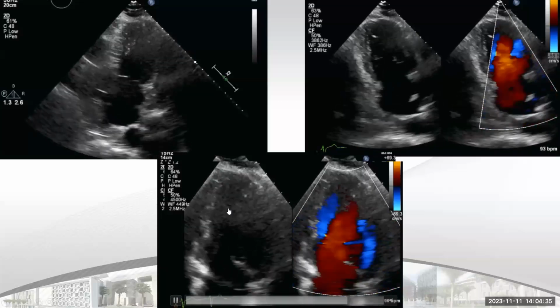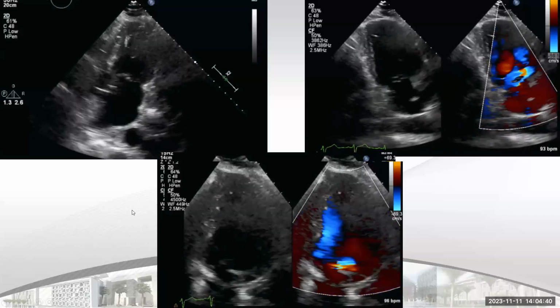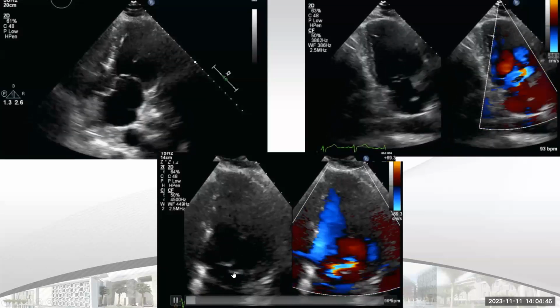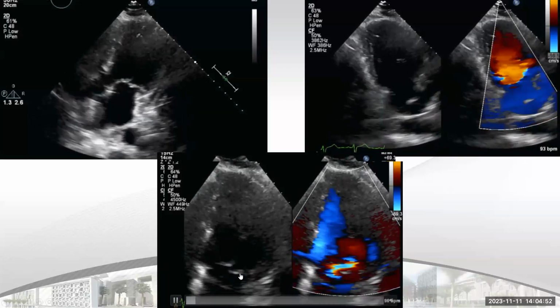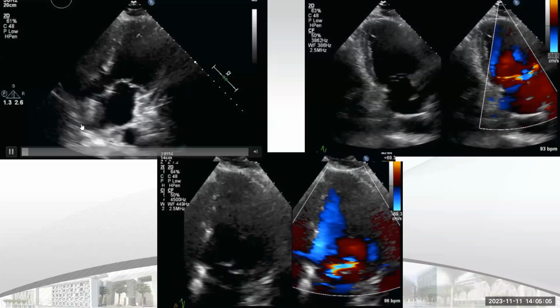If you have very eccentric regurgitation for any reason, that means you are dealing with one valve etiology, likely perforation, prolapse, or flail. Once I stop here, you can see the closure line, or coaptation line, of both leaflets. The posterior mitral leaflet is clearly prolapsing and there is total loss of coaptation. This is called flail.